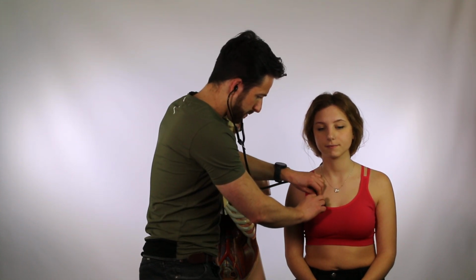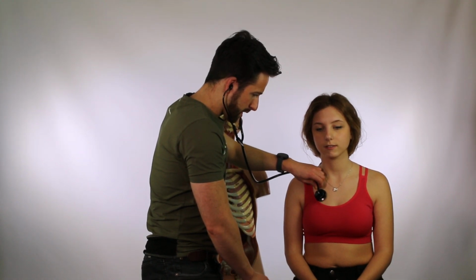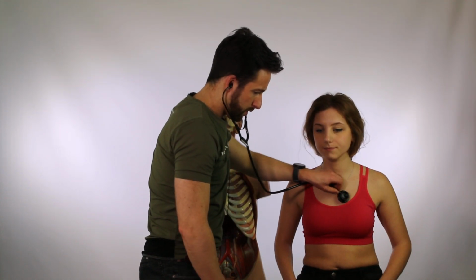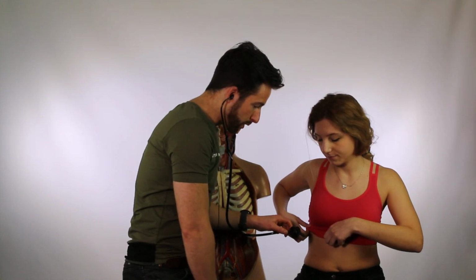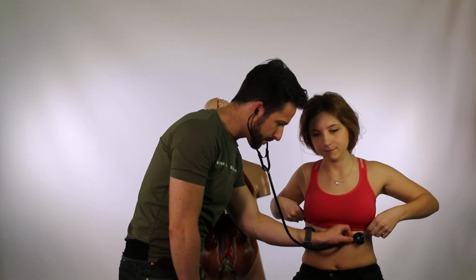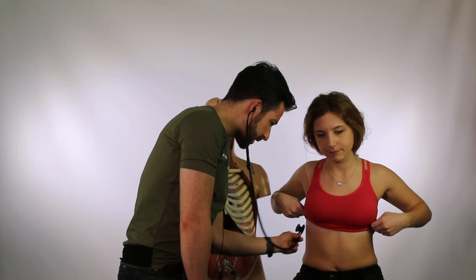And the fourth. Okay. So all I'm hearing is just normal sounds. On the website we're going to differentiate abnormal and normal. Okay, we're going to go on to the next one. And last one.